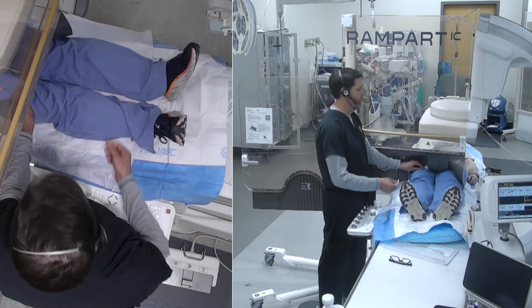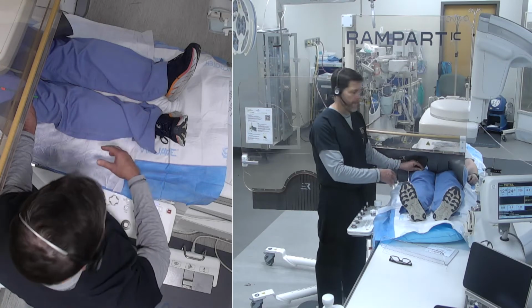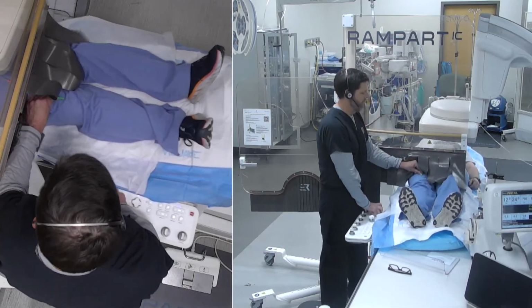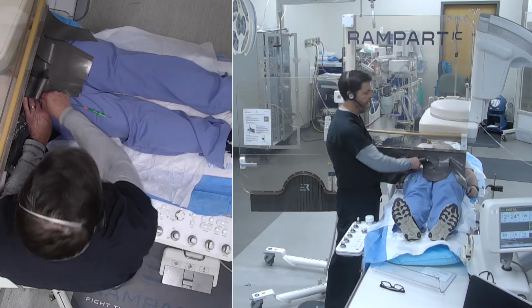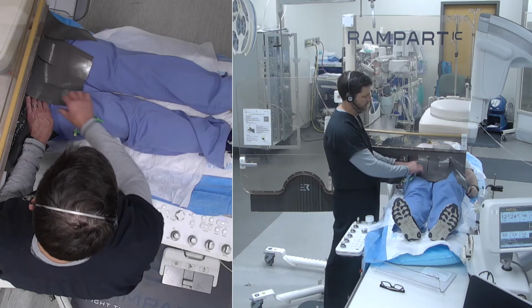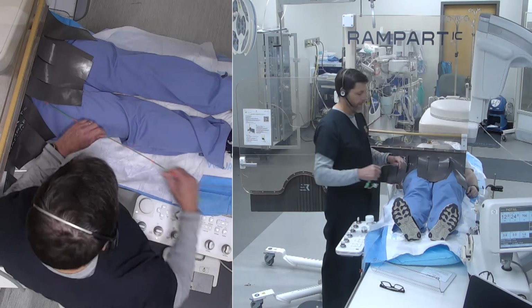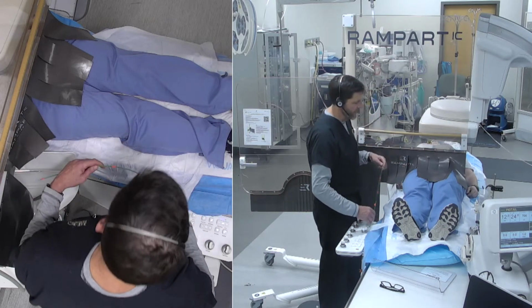Okay. Even so, if you wanted to get all the way down to below the knee on the left leg, again, you can just advance the patient in and see below the knee. And advance the patient back if you need the groin access. Once again, I do secure the catheter. That way, the rack accessory soft shielding won't pull it out. So that is right to left leg. Okay. And I put the patient basically in the standard position. My table set up exactly the same way.